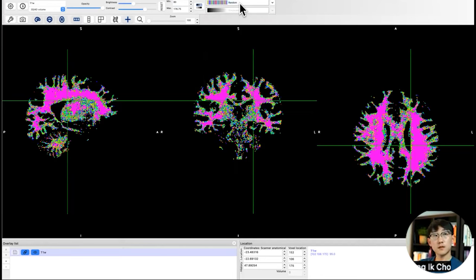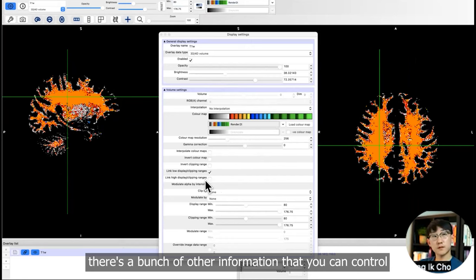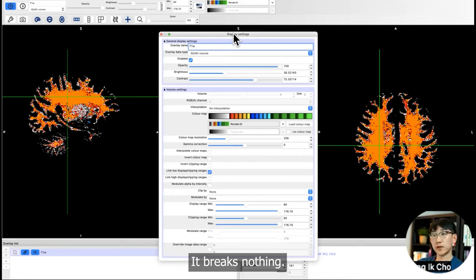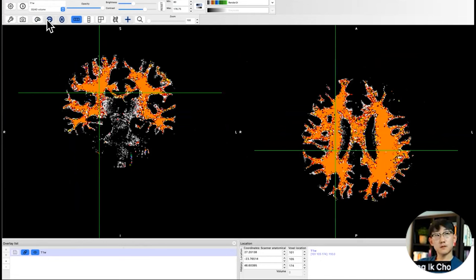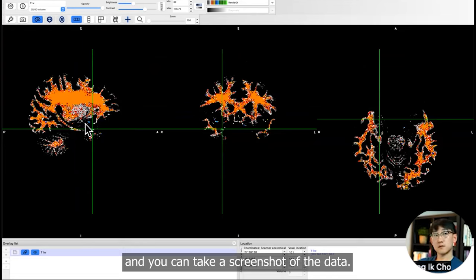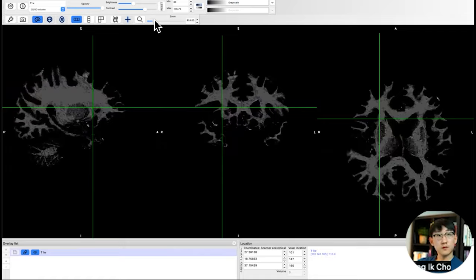If you click on this settings button, there's a bunch of other information that you can control. You can play around with it. It breaks nothing, so you can click on anything. You can also change your views, focus on specific axes that you want to, and you can take a screenshot of the data.